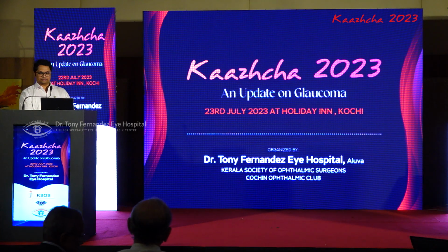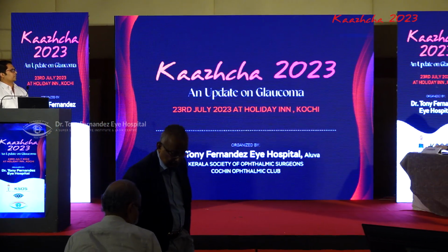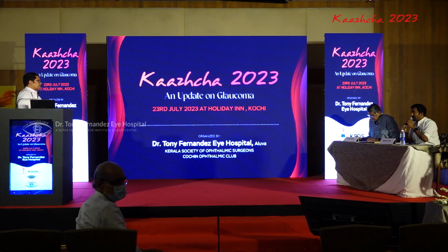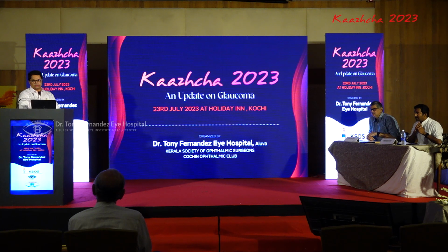Thank you, Dr. Manoj, for a very master class on gonioscopy. I think all the PGs here have a lot of questions, but there's one question which I want to ask. What would you advise the PGs to use as their first gonioscopy mirror? What should they buy? Goldmann is easy to learn because it's much more stable, but as a glaucoma consultant, we will need to progress into a 4-mirror gonioscopy because it is much quicker, it is more comfortable to the patient, and of course you have the advantage of doing indentation gonioscopy. Unless somebody is extremely a master in doing Goldmann type with the indentation, I'm much more comfortable with 4-mirror to do an indentation gonioscopy.